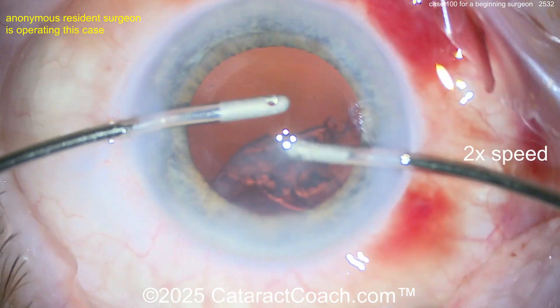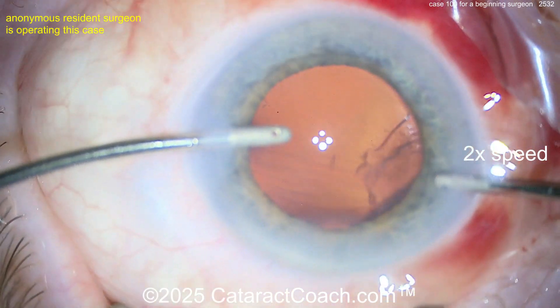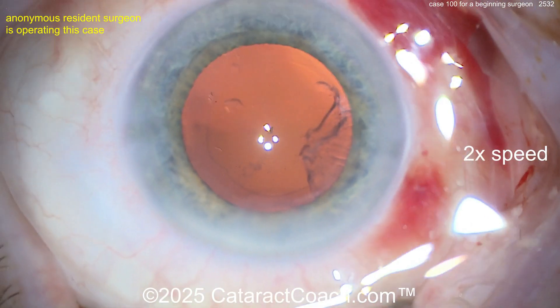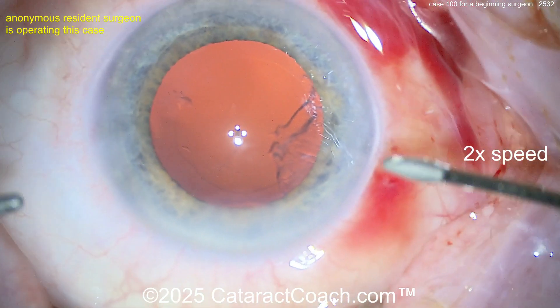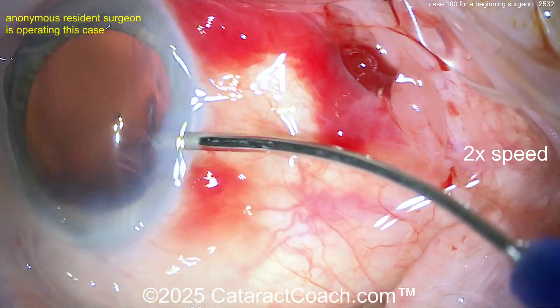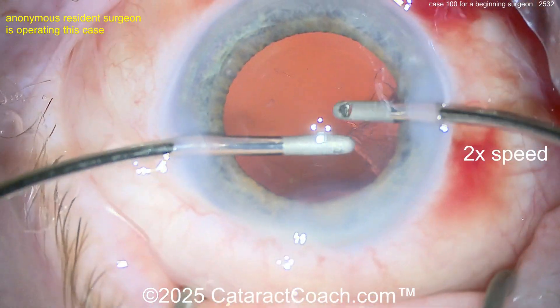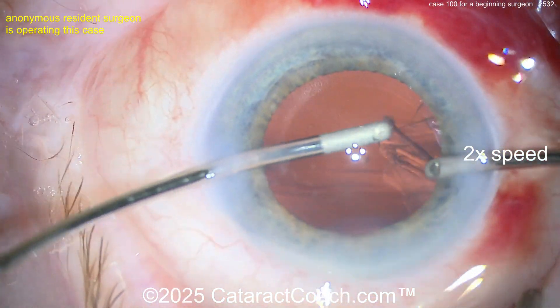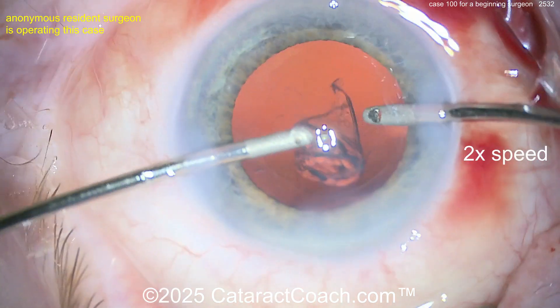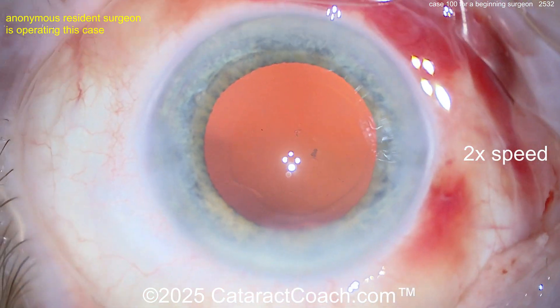You'll see a lot more stability with bimanual technique — you're limited as to how much you can suction out of the eye, so the inflow and outflow balance will be a little better. Now switching hands to get good access — infusion on the right hand going into the eye, then left hand going inside. You're doing a pretty good job — for a young doctor, I commend you. Just by sending a video in, you show me you're serious about your learning.